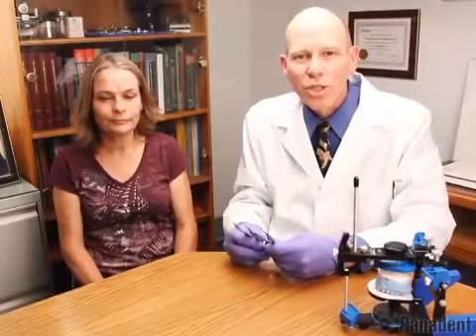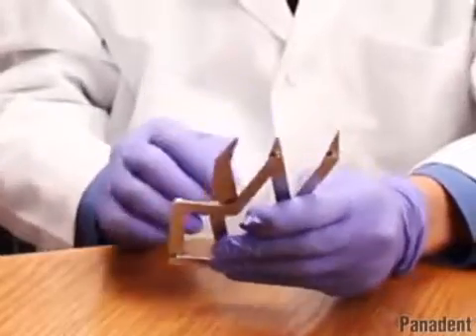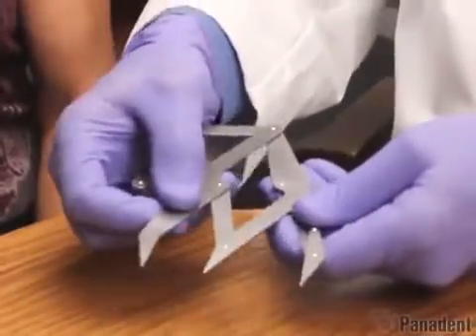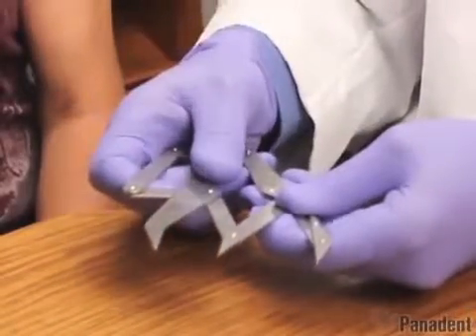Hello and welcome to my demonstration of the use of golden proportion in articulation. Golden proportion ratio is a ratio of 1 to 1.618. We do have the golden ruler here that maintains that golden proportion ratio. In other words, whatever this distance is, this is approximately 60% wider.